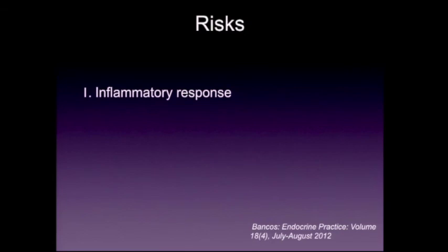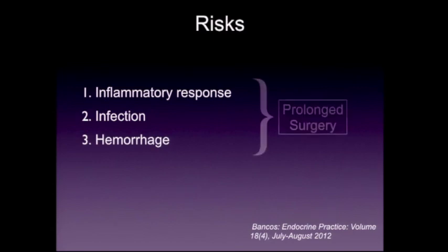There are some risks for doing this. Some articles refer to causing an inflammatory response. Of course, there's always a risk of infection. I think these risks are relatively low with proper technique. Similarly, with the risk of hemorrhage, the risk should be fairly similar to doing thyroid FNAs. If these things happen, this can prolong the subsequent surgery, but again, these things are uncommon.